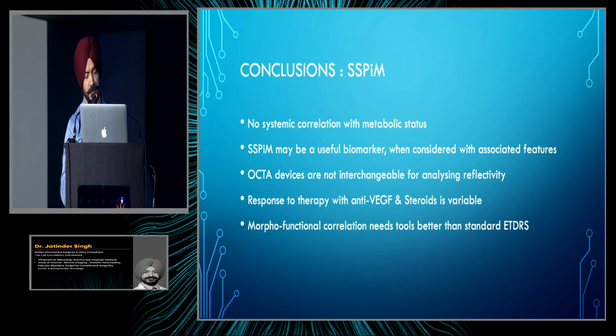Yeah, thank you very much, Dr. Singh. So my question to the panel would be, in your practice for DME management, when would you actually advise OCTA for the patient to detect SPiM?